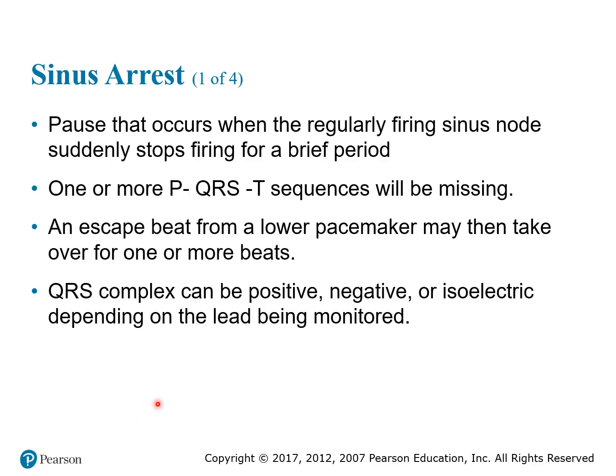Sinus arrest. Sounds kind of bad. Anytime they use the word arrest associated with the heart, right? Sinus arrest is a pause that occurs when a regularly firing sinus node suddenly stops firing for a brief period. This is when the sinus node is firing like it's supposed to, and then for whatever reason, out of the blue, it just quits for a second, and then it'll come back.